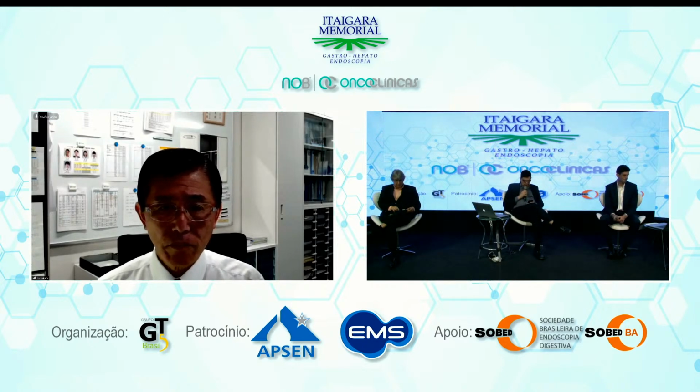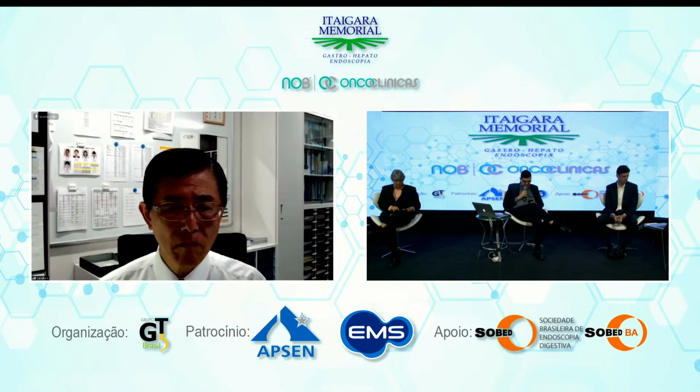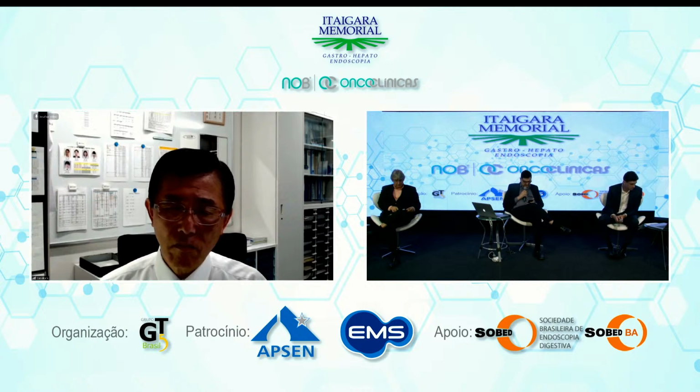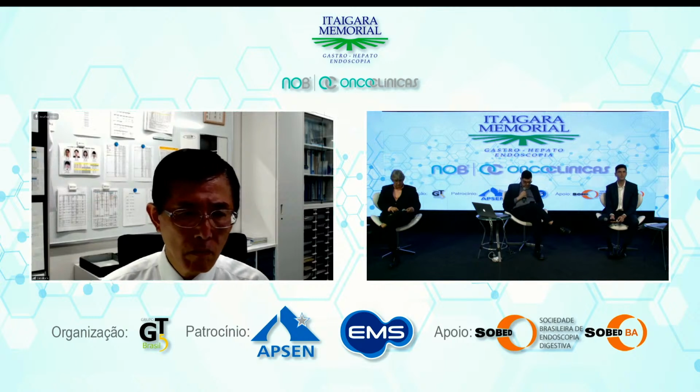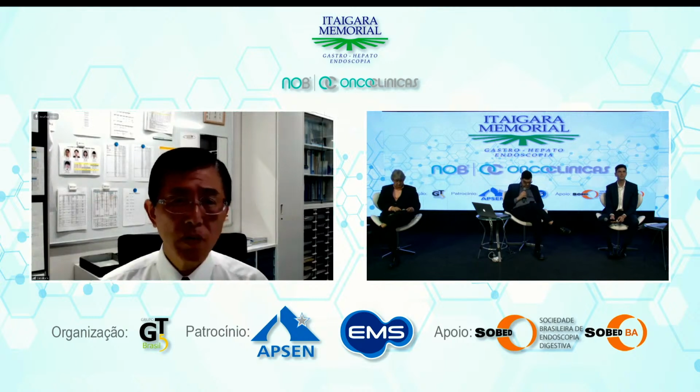A question from Daniela from Goiânia regarding NBI technology to improve endoscopy and characterize colon cancer. What should be good for the Brazilian reality? JNet? For the Brazilian reality, do you think that JNet would be suitable? Yeah, of course. JNet is very simple.